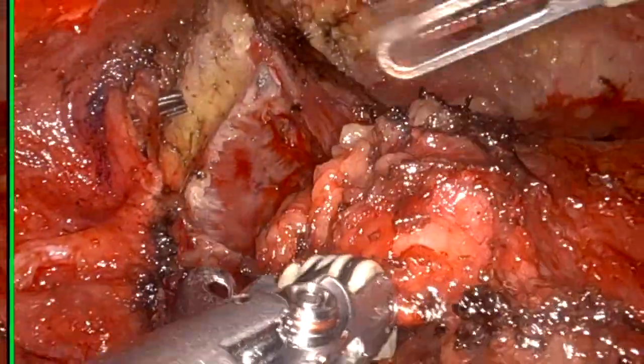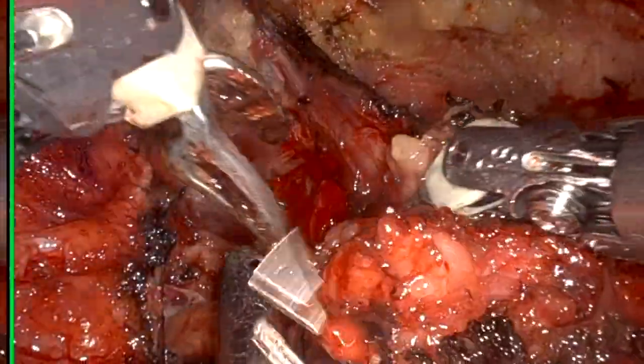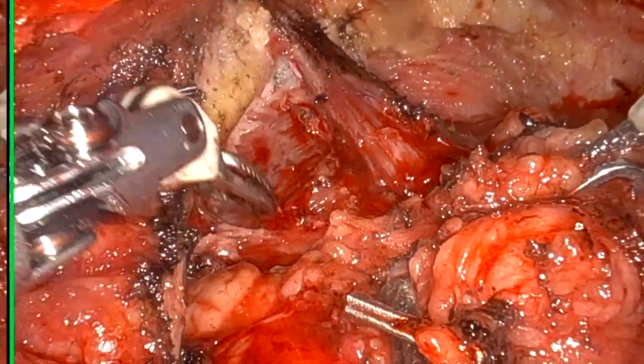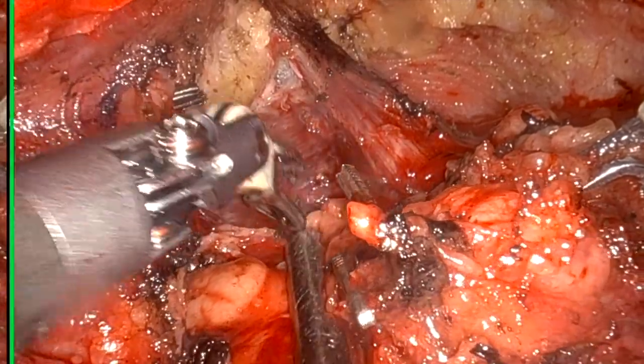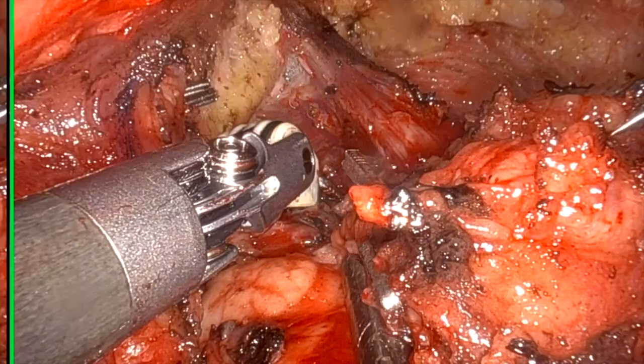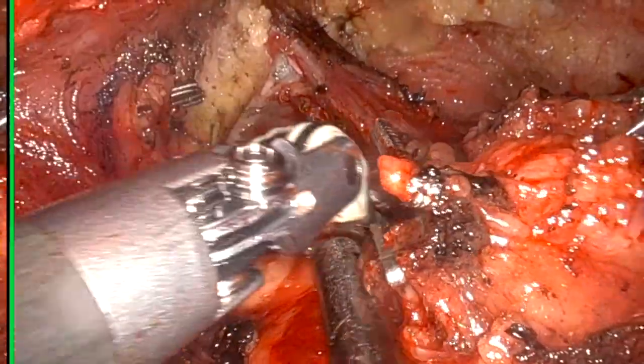So after looking for the facial artery and common facial vein, we came back again along the border of the mylohyoid muscle. Now we will look for the hypoglossal nerve, duct and lingual nerve.